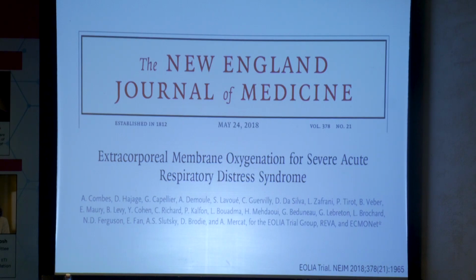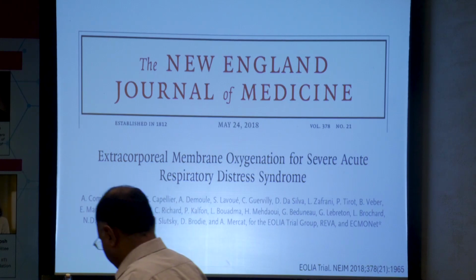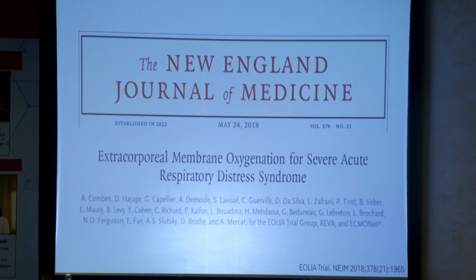And so EOLIA was a really strictly controlled trial of ECMO versus non-ECMO with specific protocols for how you manage ARDS without ECMO, how you manage ARDS with ECMO, how you manage the blood transfusion, how you manage the ventilator. It went much more into the details than the previous trials had even attempted to do. I'm not going to go through all of those details now because we don't have time, but this is the best level 1 evidence that we have for ECMO versus non-ECMO.